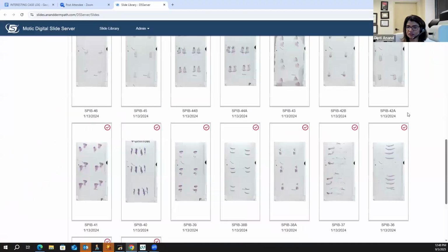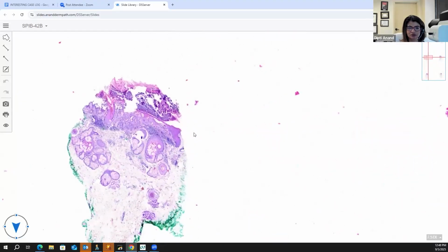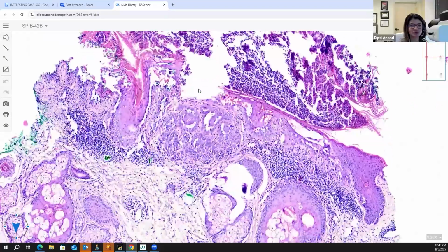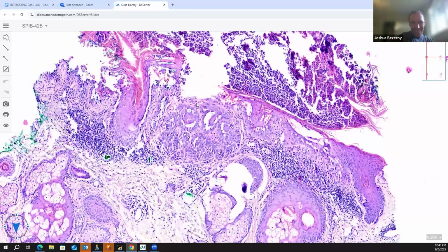Or maybe there was a 42B with this. That is why you favored Darier. What is happening in the 42B? I think in 42B, it's involving the hair follicle. Yep. So you kept quiet. You let me go on. Yes, you're right. This is Darier.